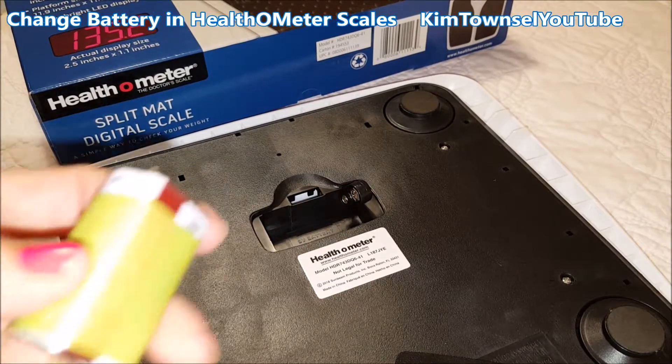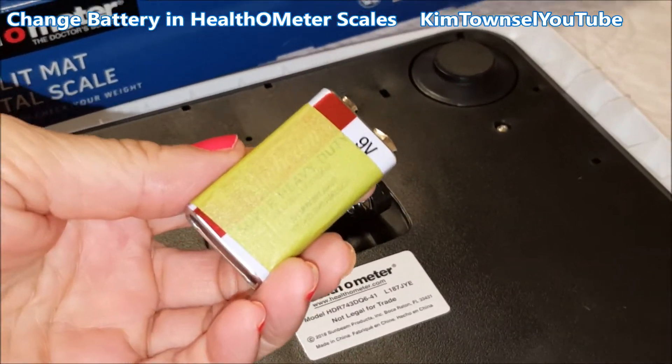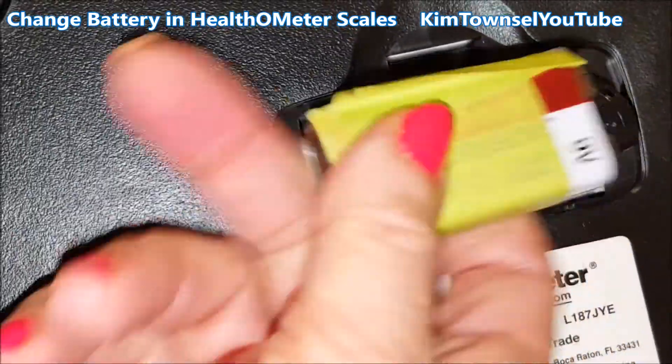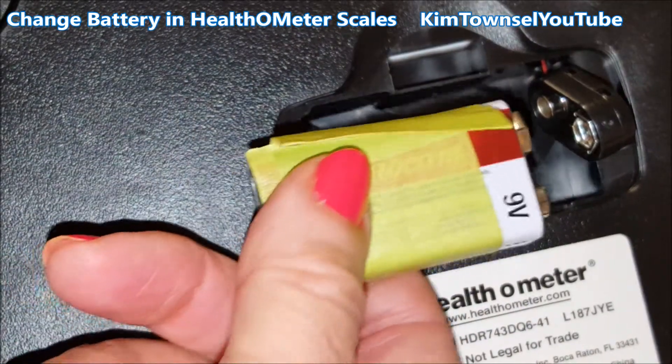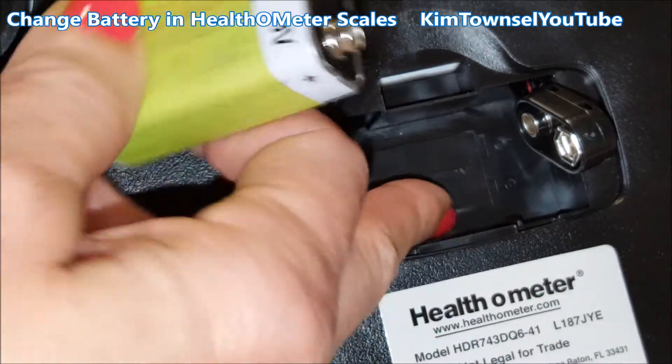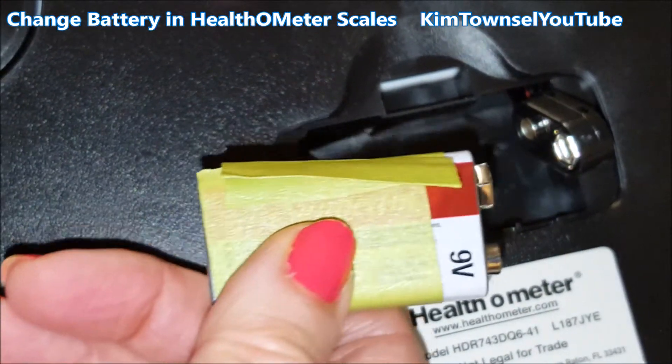This video is long overdue. A viewer asked how to put the battery in, and when I was looking at it I saw that there wasn't a ribbon or anything underneath it to get the battery out. So if someone's already put a battery in, you're probably just going to have to get a screwdriver or something and slide it underneath there very carefully and gouge it out.